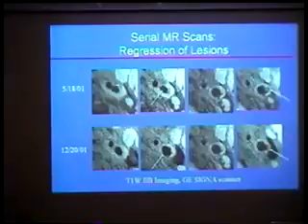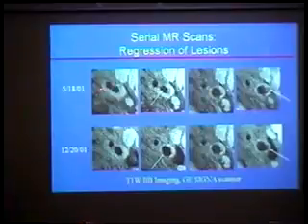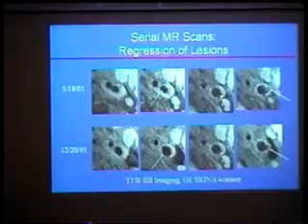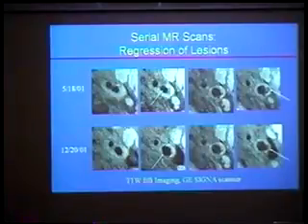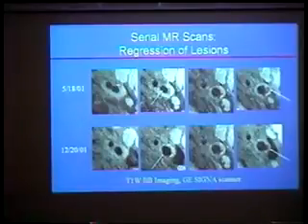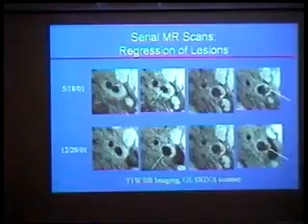Yes? How do you find the same location? We use the bifurcation as the landmark to realign patients each time. That's why, when I show the carotid artery longitudinally, you see the bifurcation. We always go back to that bifurcation each time we do our protocol. Suppose you want to do 15 images, we ask that the 7th image always is where the bifurcation is. By doing this, it has been fairly consistent, so you can get the same location each time in the progression or regression studies.